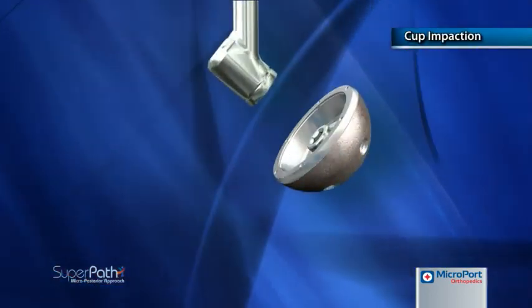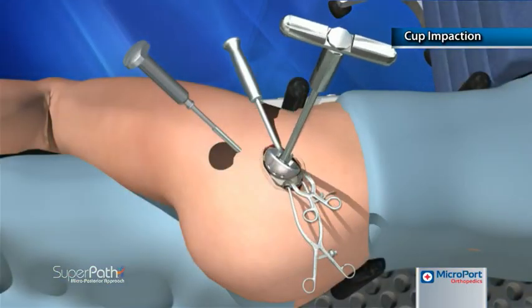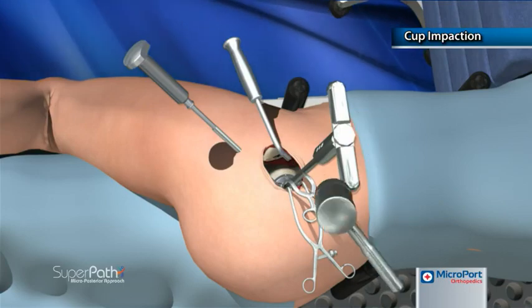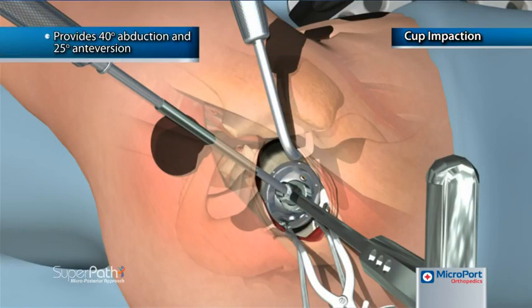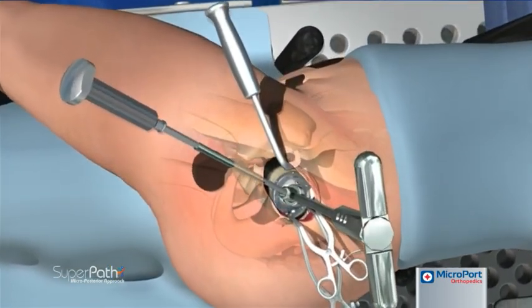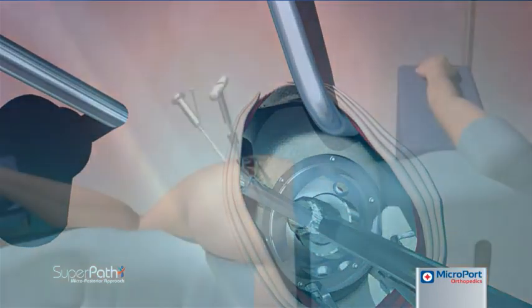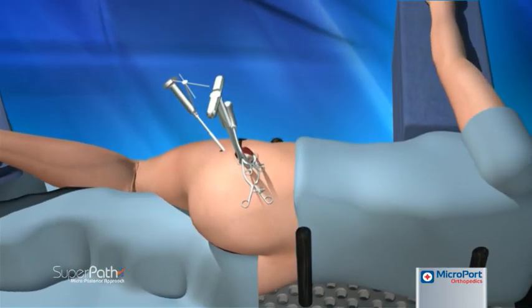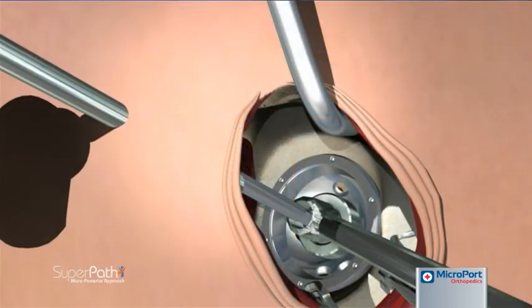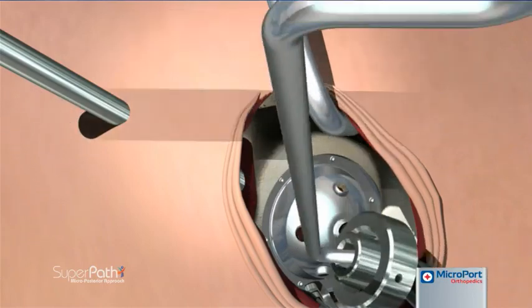The threaded cup adapter is threaded into the apical hole of the acetabular cup, and the assembly is seated on the alignment handle. With the acetabular cup in the acetabulum, the alignment handle is directly driven to medialize the cup. The cup impactor is inserted through the cannula and the tip of the alignment handle until seated in the dimple of the threaded cup adapter, and impacted until the cup is firmly seated. With the cup firmly seated, the threaded cup adapter is unscrewed using the hex tip of the cup impactor and removed using the reamer basket holder.